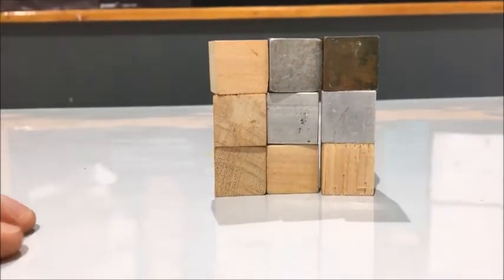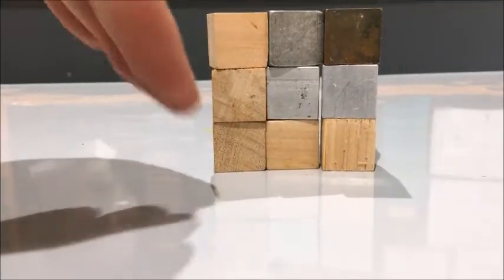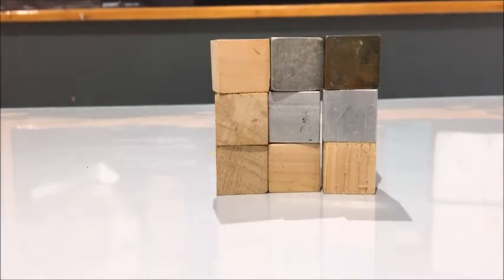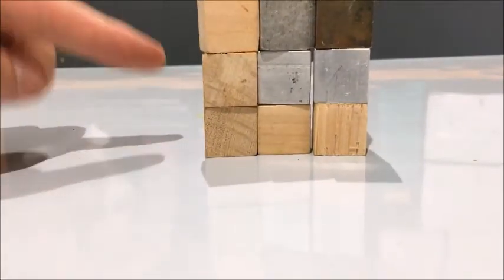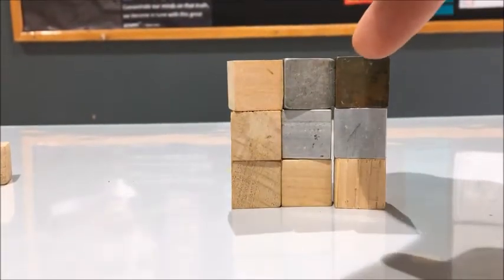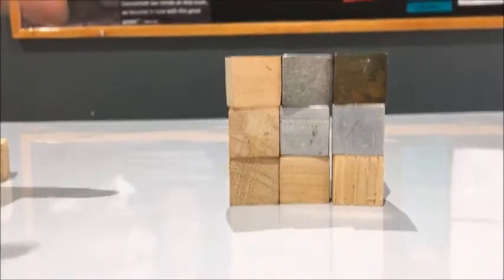So the axial part is I'm going to x-ray from this direction, then from this direction, then from that direction, then from that direction. I don't need to go from this direction here at all. So we're going this direction, that direction, and then that direction, but not this direction, because I've already got it from that direction.